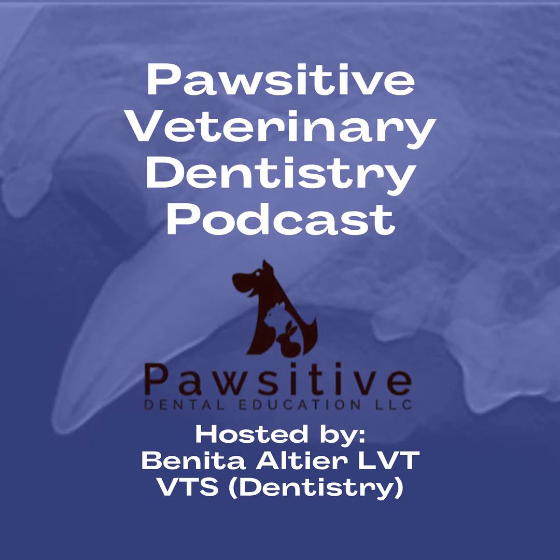For example, if there's an extra root, or maybe the roots are fused together, dental radiographs can really help you with your treatment plan to make things more efficient. Or it may give you an idea that this might be over what I'm comfortable doing, or, when talking to the owner, that this might be something we need to stage and do one side versus the other side.